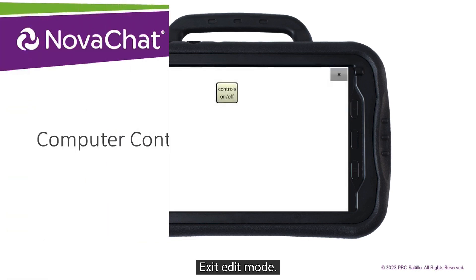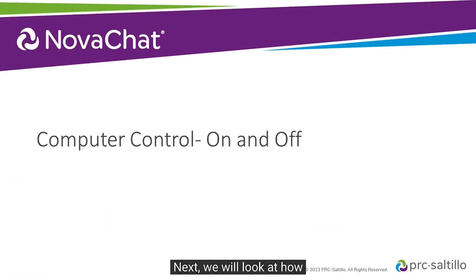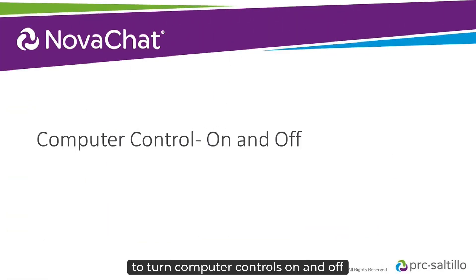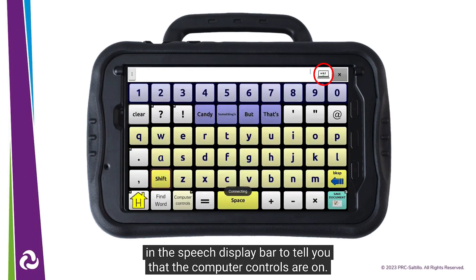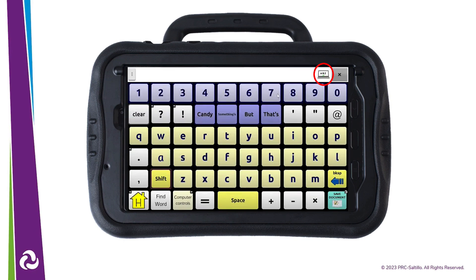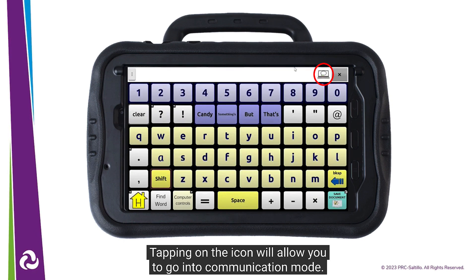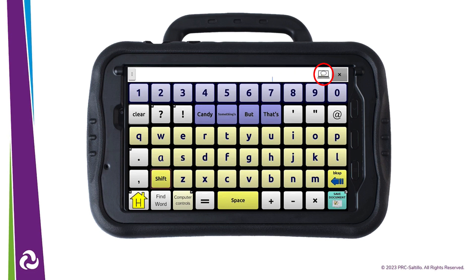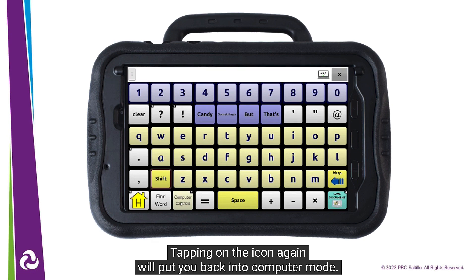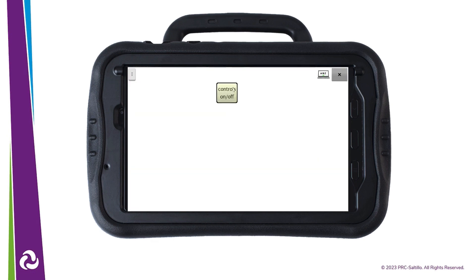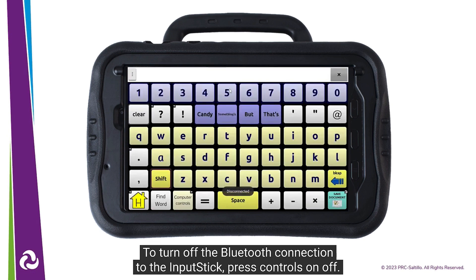Exit Edit Mode. Next, we will look at how to turn computer controls on and off. Press our new button. You will see an icon appear in the speech display bar to tell you that the computer controls are on. Tapping on the icon will allow you to go into Communication Mode — this allows you to talk with your NovaChat and not have the text go to the computer. Tapping on the icon again will put you back into Computer Mode. To turn off the Bluetooth connection to the input stick, press Controls On Off.